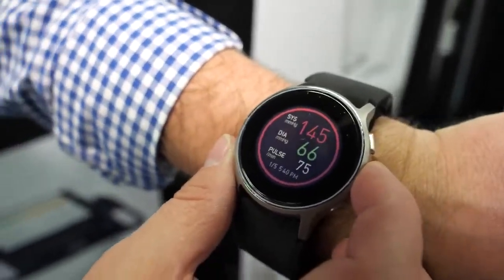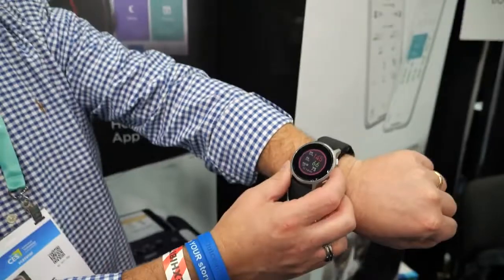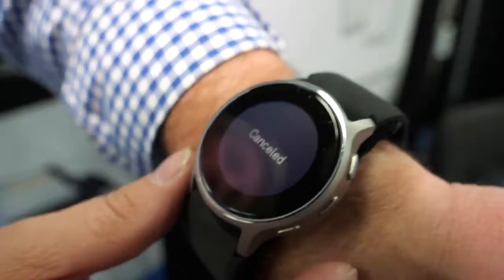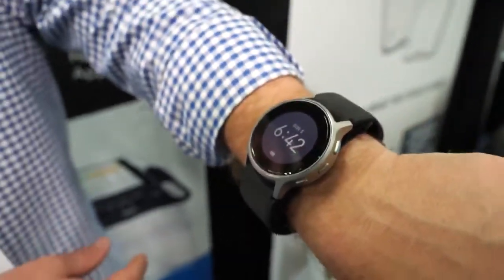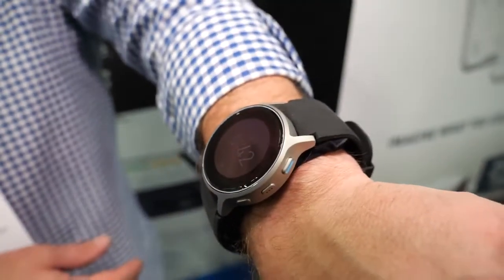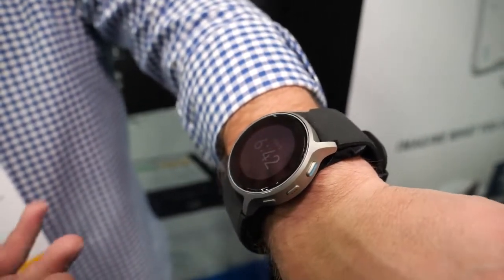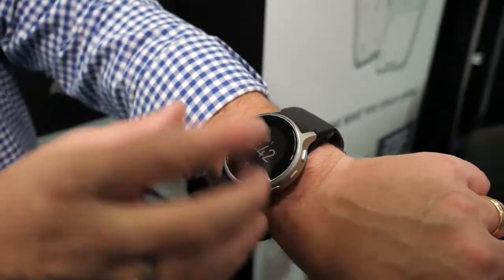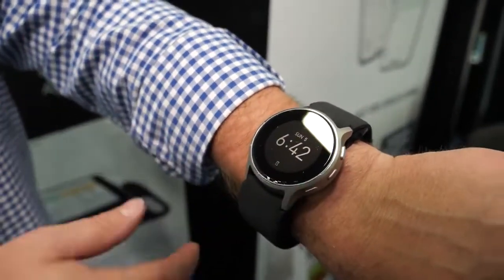Here's a blood pressure monitoring smartwatch from Omron. Jeff Ray, executive director of product strategy at Omron, introduces the HeartGuide device — a wearable blood pressure monitor. It's the only FDA cleared home blood pressure monitor that's wearable. They essentially took a normal blood pressure monitor, shrunk it down to something wearable, announced it at CES last year, and launched it about 11 months ago.